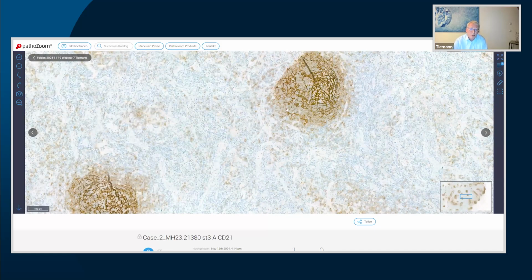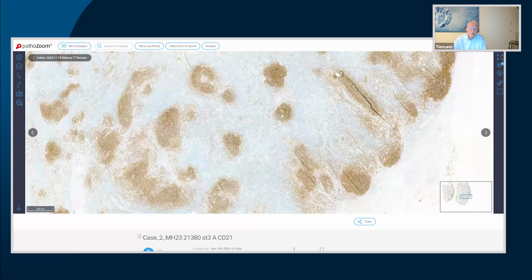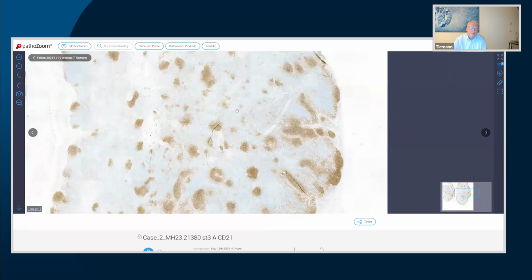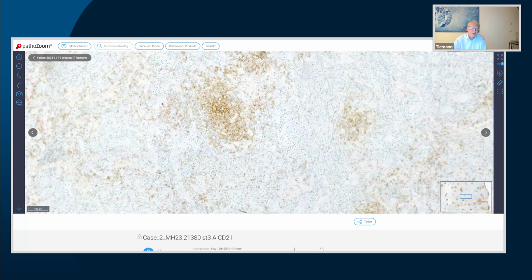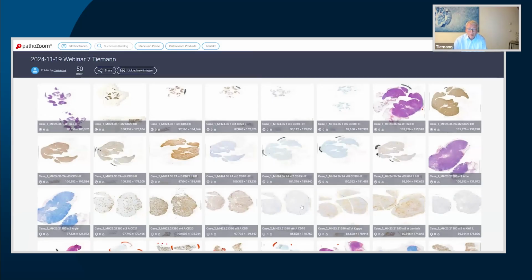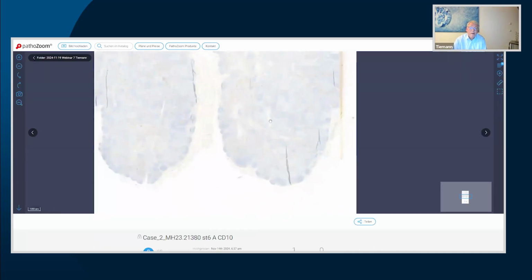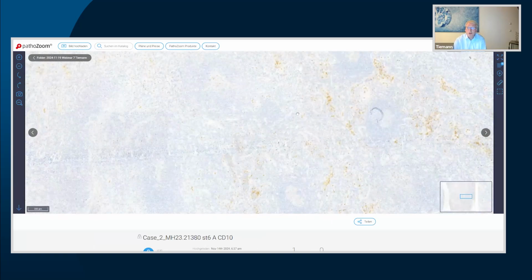These destroyed networks are mainly found in lymphotropic virus infections, especially HHV8, but also in hepatitis C. Here, progressive change, germinal center. Okay, going back. We look for CD10. This is a surprise. So the reaction has worked.